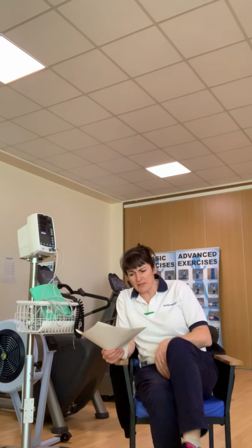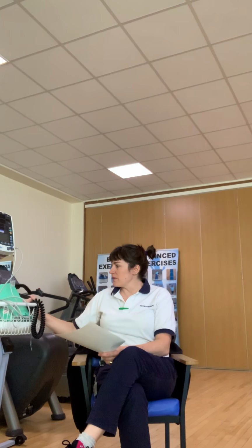So, this is part one of the presentations I'm going to do, and I'm covering taking observations and mobility as well. We'll be using this Dynamap here. Who here has absolutely no idea how to take any observations or read them on Patient Track? Okay, that's fine, that's good.